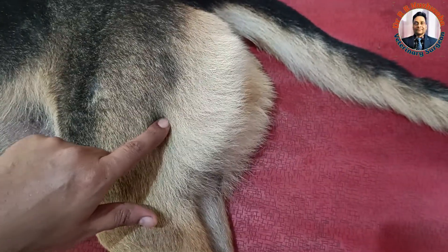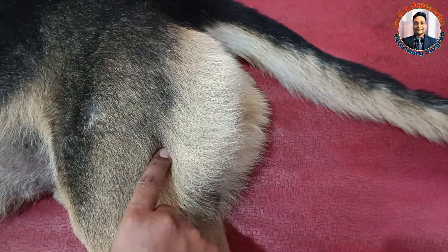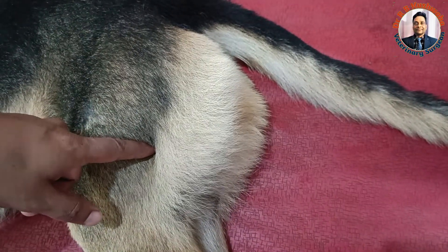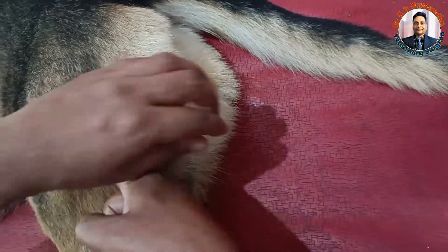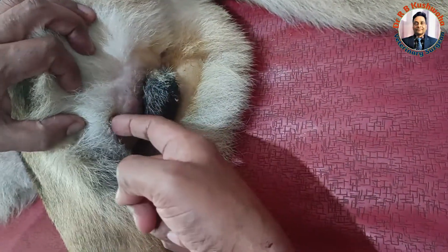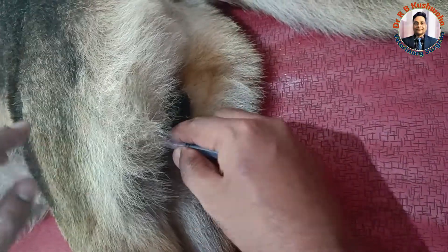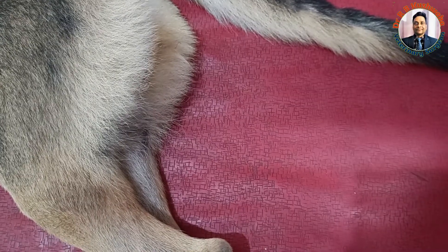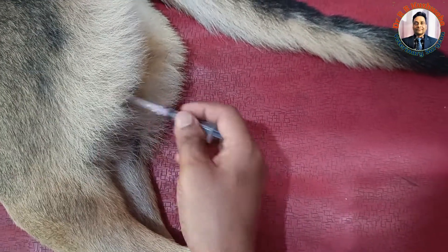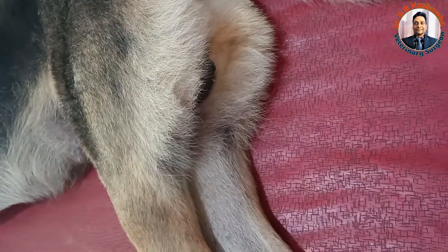To inject the drug in the semimembranosus muscle area, one approach is to go directly here. But in the same muscle, you can also inject from a different angle. Some clinicians insert the needle from here like this, going up to this level. So either approach is acceptable — this is another valid technique.